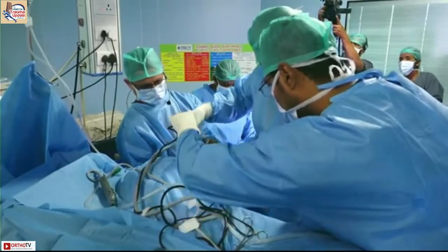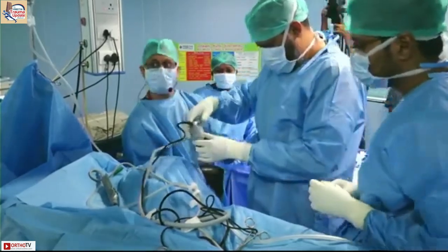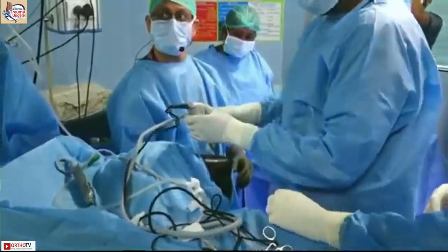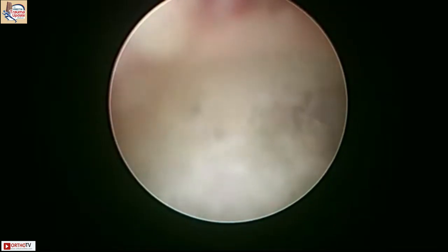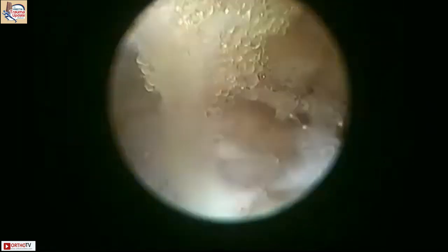So in post-traumatic stiff elbow, this step is very important. Yeah, so in post-traumatic stiff elbow, these are things you would want to do. See, he's on the, can you see? Yeah. So things you want to assess are what all compartments you want to visit and how much work you want to do on each compartment. Because no matter how much you do arthroscopically, it's always less. Because it looks very big, or you feel like you've done a lot. When you get an x-ray of these patients, you have done just about the bare minimum.